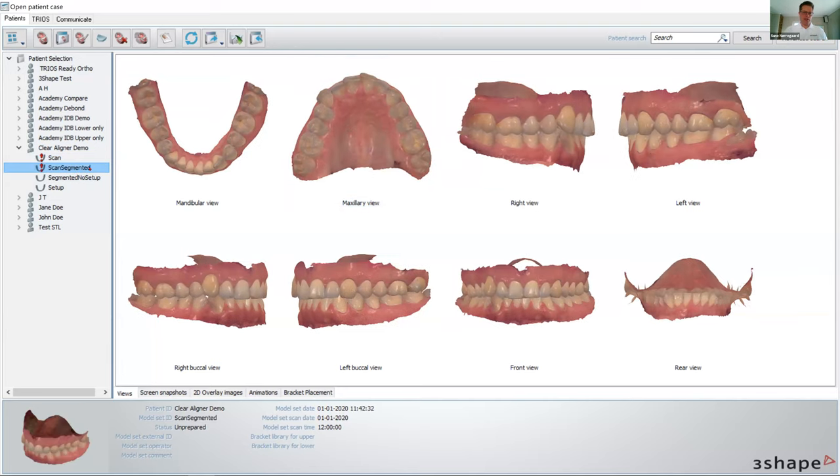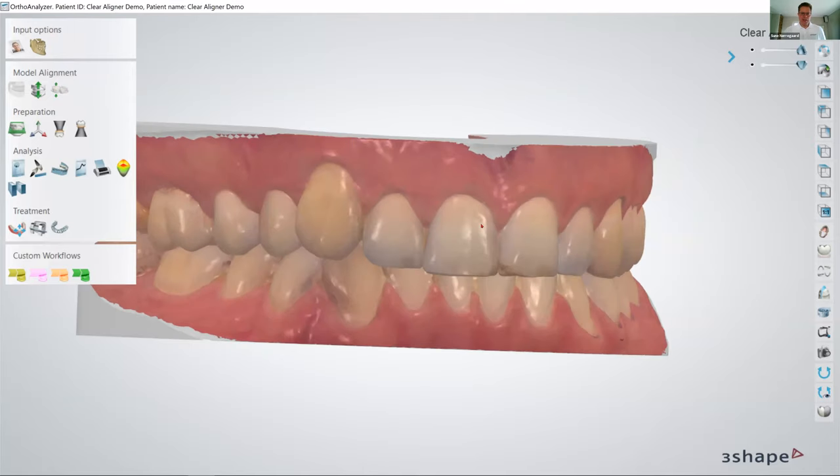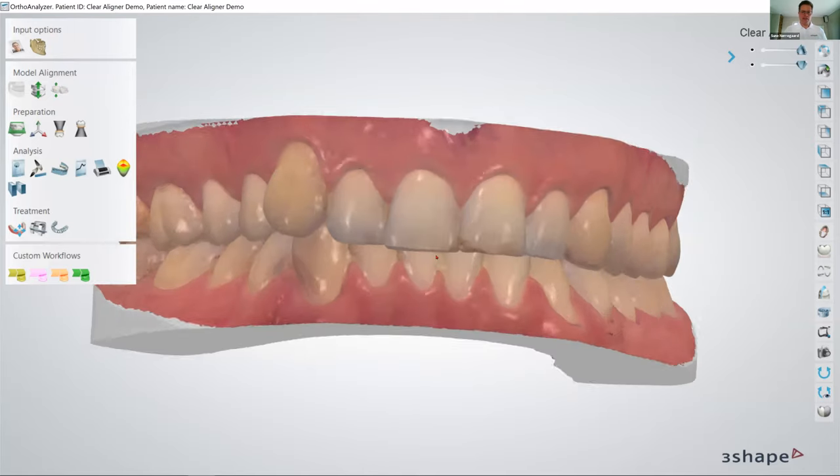Here I have a scan with segmented teeth, and then you can also prepare the full scan by putting a base onto the scan. We call it, in our world, and I think it's the same in Formlabs, we make the object watertight so that there are no holes whatsoever. That means that it's a solid 3D object that you can then send to a manufacturing device of some kind. It could be a milling machine or a 3D printer, and then it'll use the coordinates to print the physical object.